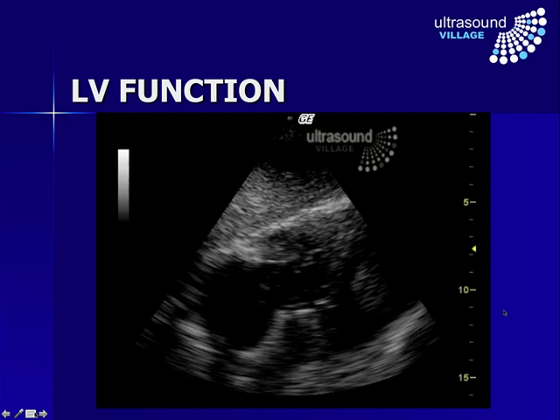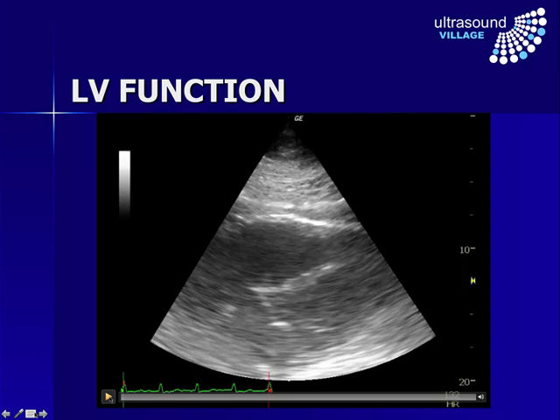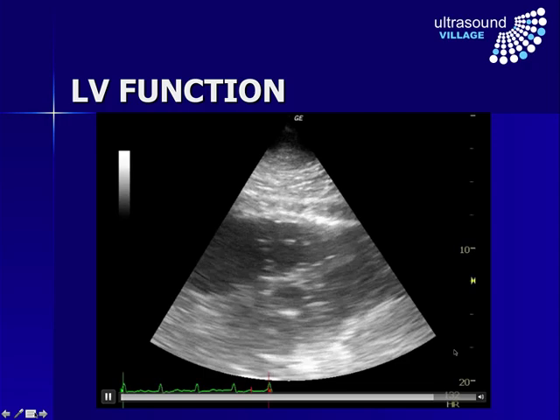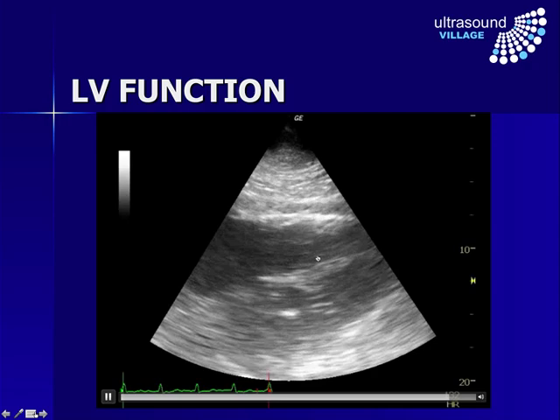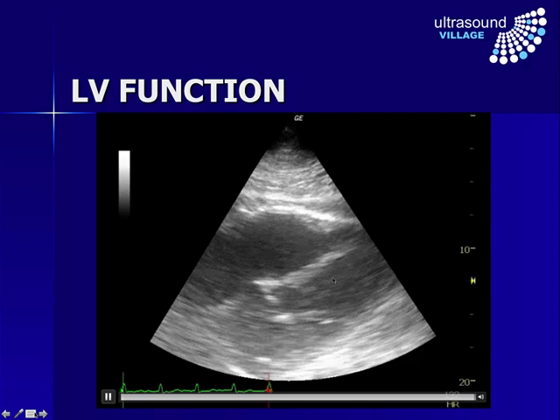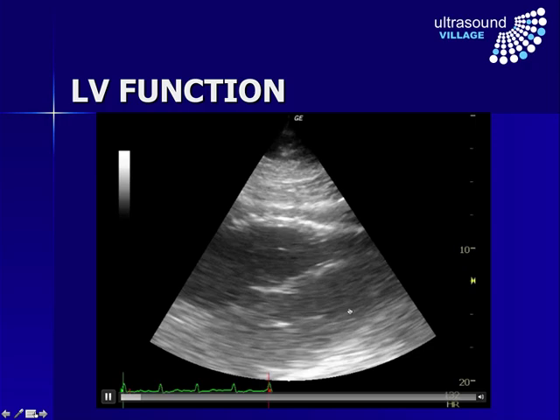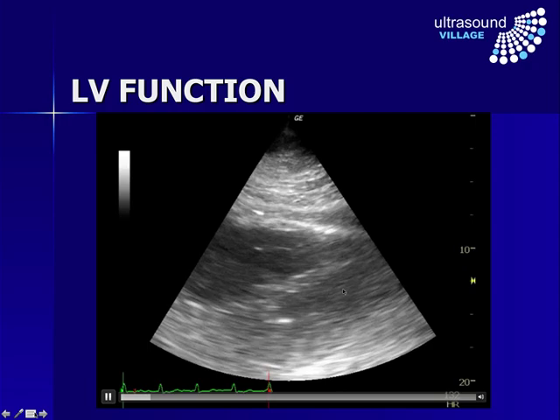Here, on the other hand, is an elderly man who presented with hypotension and a fever. Here is a subcostal view. We can see the right ventricle, the left ventricle, and we can see there's good thickening, lots of movement, a small cavity size if anything. This is a hyperdynamic heart.